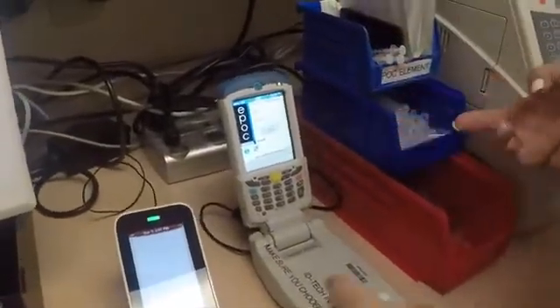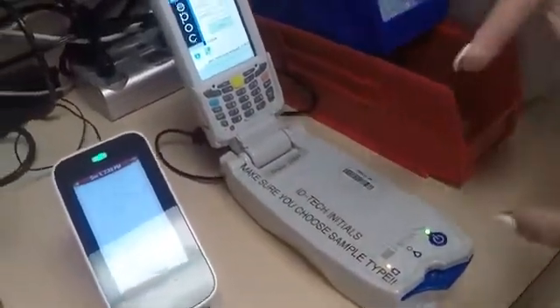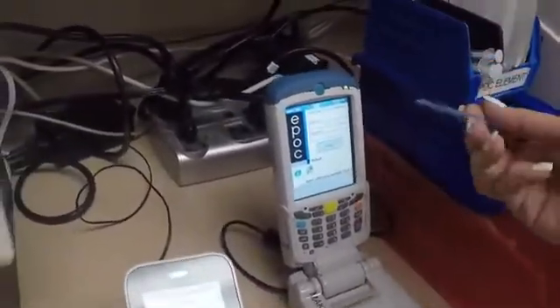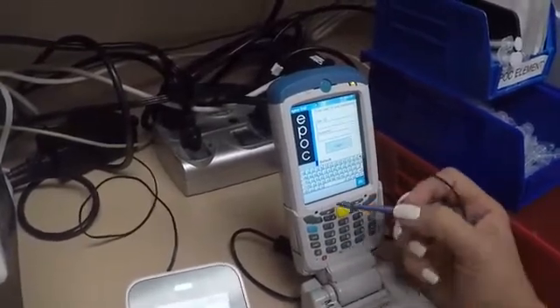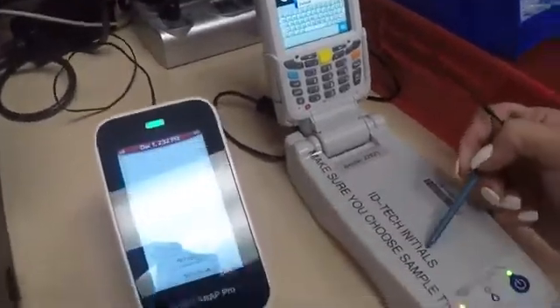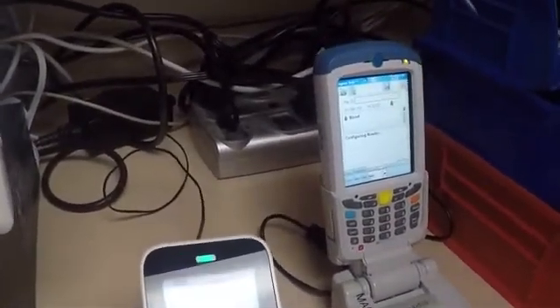This is the unit right here. There are two power buttons if it's ever turned off — the power button for the host, which is what this top part is called, is that red button, and then the reader power button is this green button. If you ever try to connect and it's telling you it can't connect to the reader, that means this bottom part is not turned on. To log in, you can use this little stylet on the side. In the corner is a little keyboard you can tap to type in your information. We don't need a password to log in, but we do need a user ID — the ID is always the technician's initials.